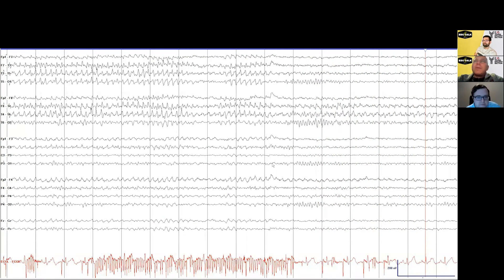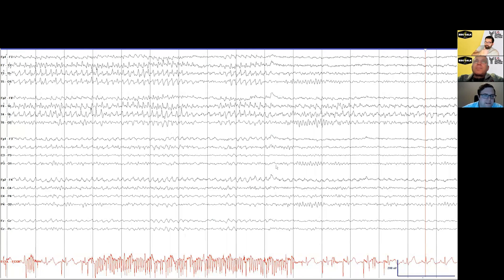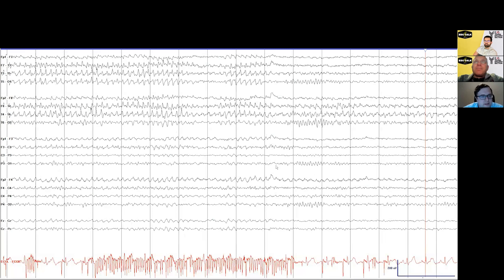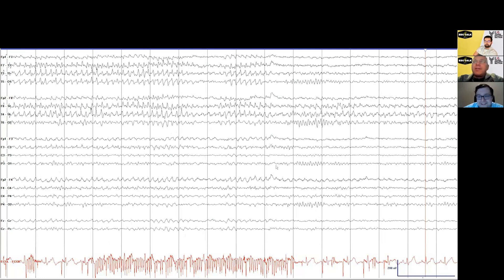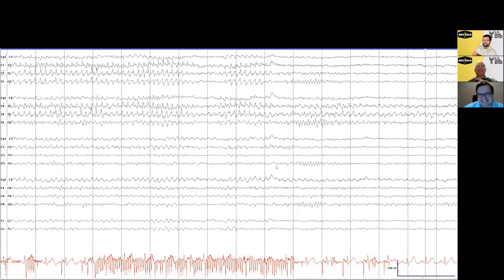All right, okay. I'll switch up the report now. Does this always occur in drowsiness, Dan, or is it, do you see it in N2 or N3? So you can see it in light sleep. Again, there's cases of it being reported as deep as REM, but it's very uncommon. You really have to be sure you know what you're looking at when it's in NREM or REM sleep. But restful wakefulness, drowsiness, and light sleep are the common places to see this. In REM you said there's been just a case of it? What? Yeah, I haven't seen it, but what kind of dream does that person have? They're dreaming of RMTD, I think.